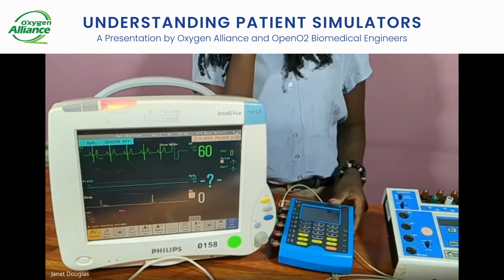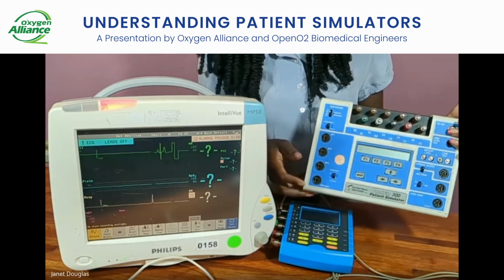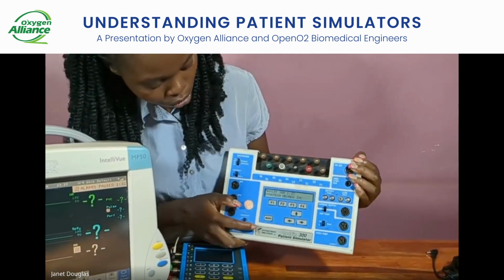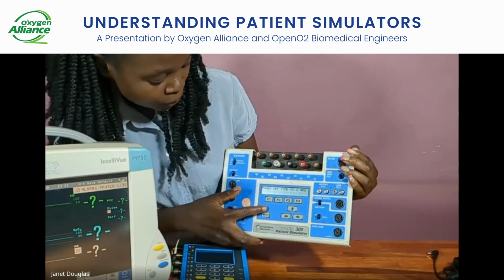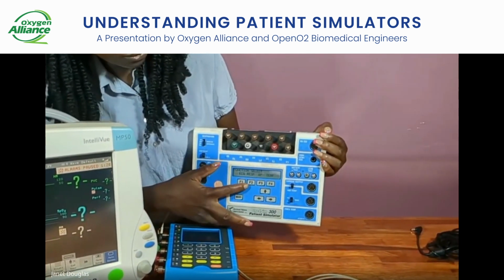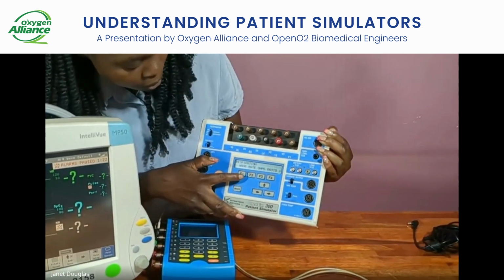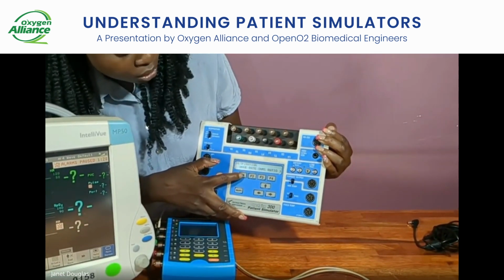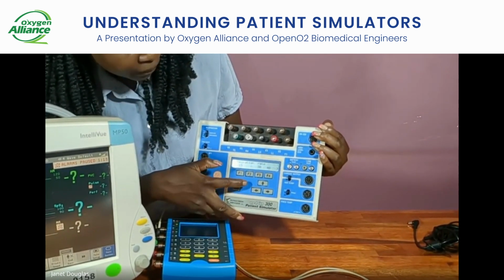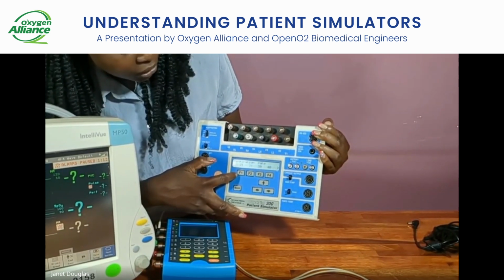So just to say the same about the other simulator, if you turn it on using this tab, it will switch on, and then it's showing you different functions. There's ECG, respiration, BP, based on the F1, F2, F3, F4. So if I choose F2, which is the respiration, it's going to give me whether I want to know the wave, the rate, and I can also choose, let's say, the rate. And the F1 here is standing for now 15.